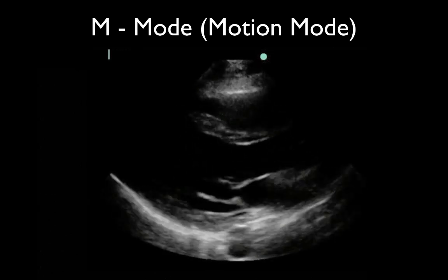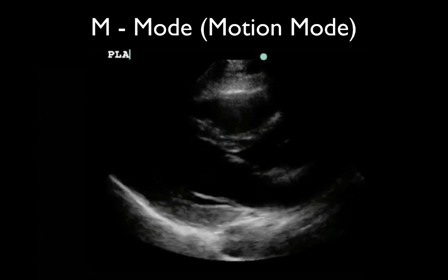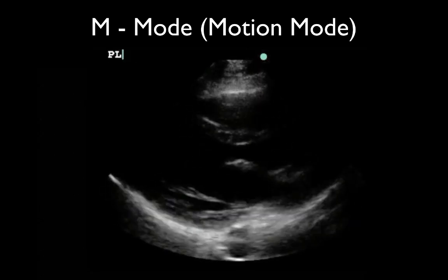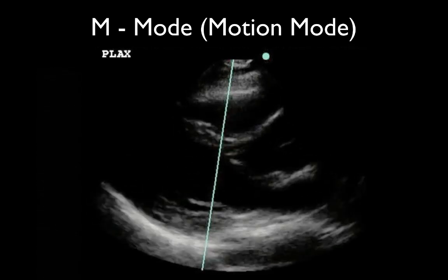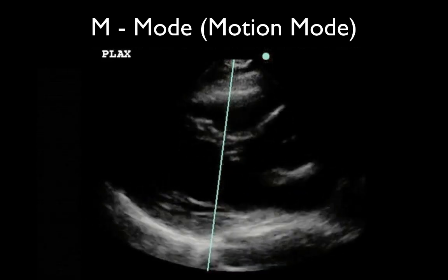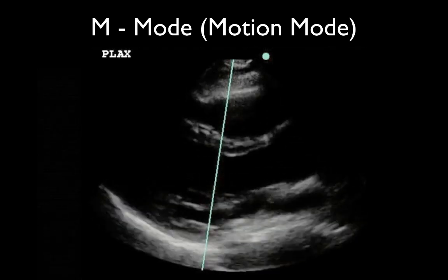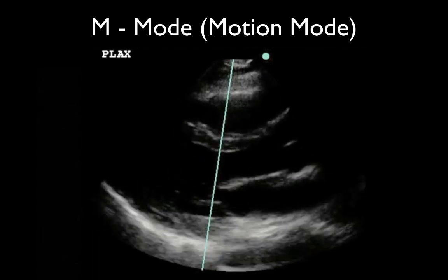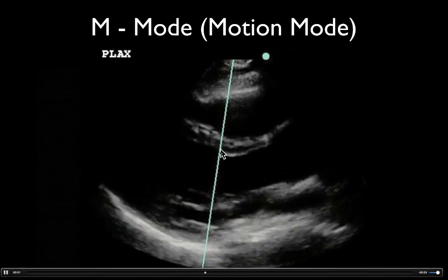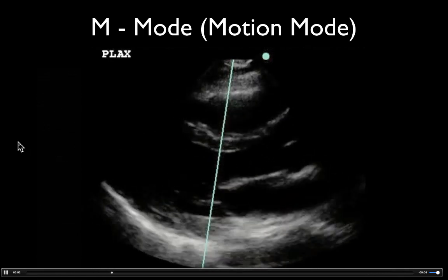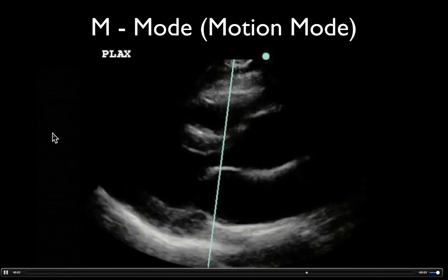But if we want to measure that, document it in a still image, or because our eyes can't appreciate it as well, we can do a motion mode. What we do is hit the M-mode button on your screen, and it'll give you this line. You take and place that line where you want to get your sample — it's a sampling line essentially. We put that right where we want to be, placing it right over that distal tip of the anterior mitral valve, right where you can see it flipping up.